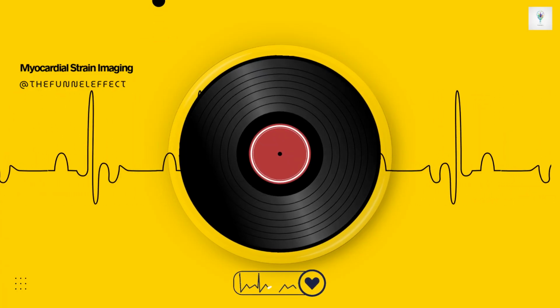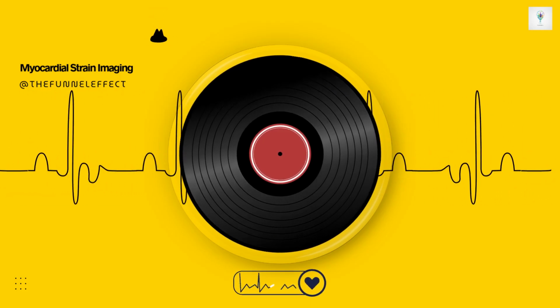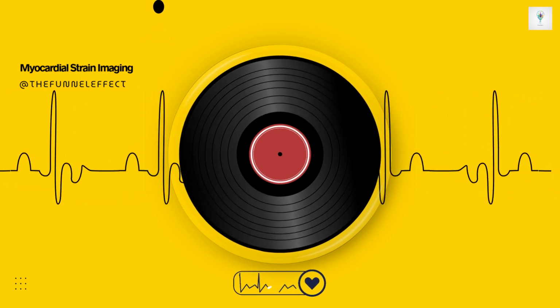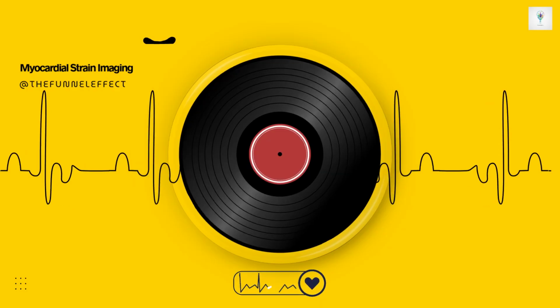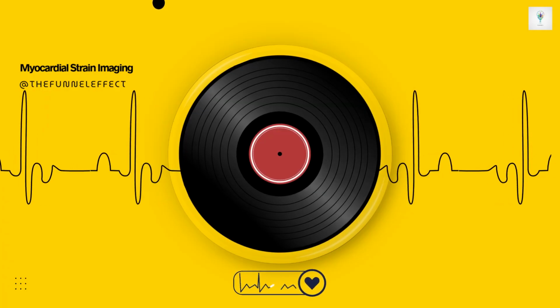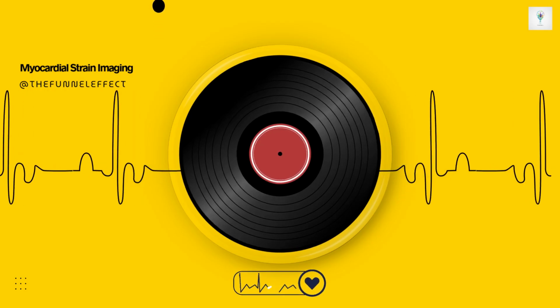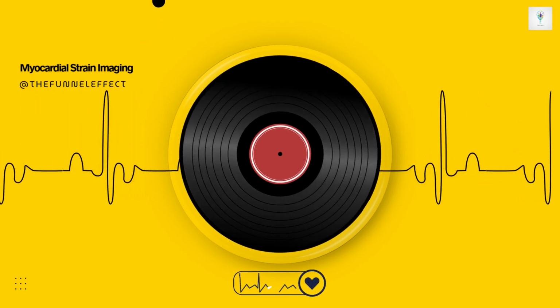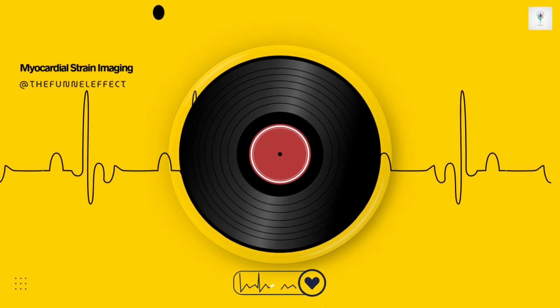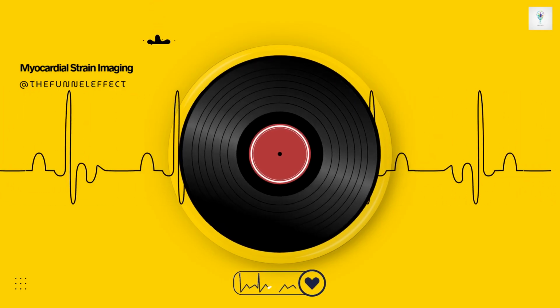Okay, and the third mechanism, hypertrophy and pseudonormal function. This sounds important for specific diseases where the heart walls get thick. Yes, this is crucial for understanding conditions like hypertrophic cardiomyopathy, HCM, or hearts thickened by long-standing high blood pressure, or cardiac amyloidosis, where the walls get thick and stiff. In these ventricles, you have thick walls and often a relatively small internal cavity size. Right. So in that situation, even if the muscle fibers themselves are quite impaired and only shorten a tiny absolute amount, that small amount of wall movement can represent a large relative change in the volume of that small cavity. So the EF percentage looks normal or even supernormal just because the starting volume was small.